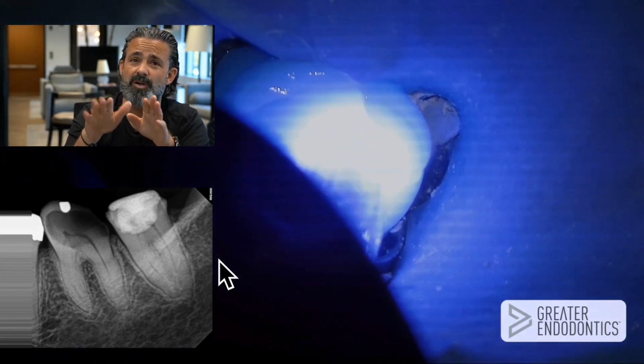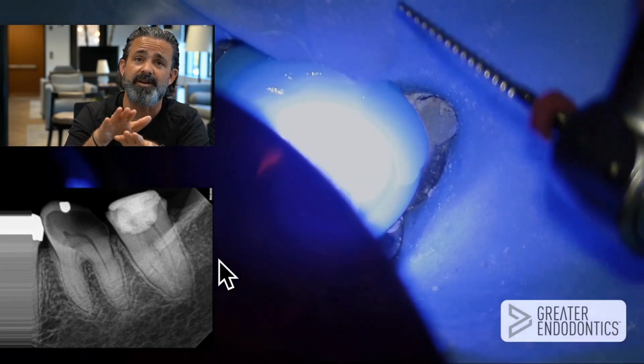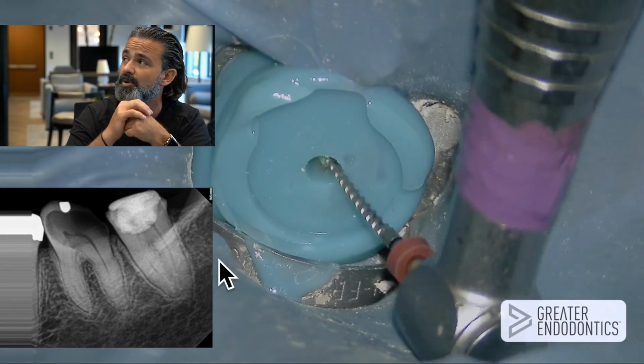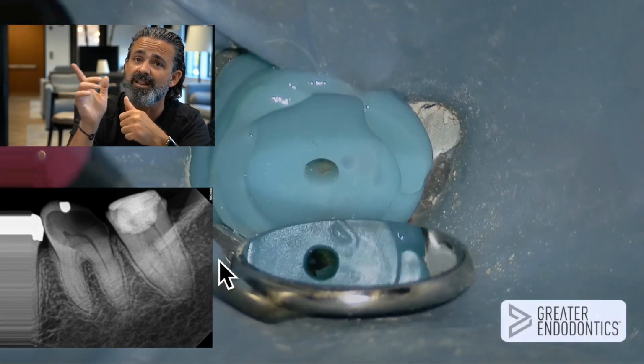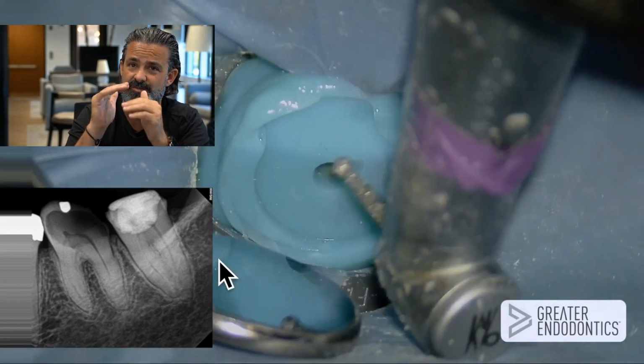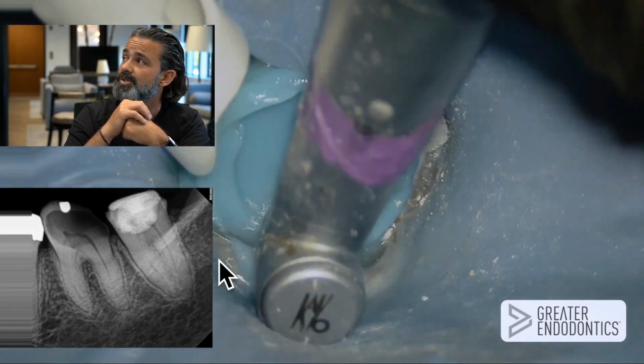So that angle, or how flat you put that rubber dam clamp on, is very important because you don't want to get it caught underneath the platform. And if you do your homework, or you're a Boy Scout, check that early on. I got lucky right there. And I find that 2AS is sufficient 99% of the time, although that was really close.